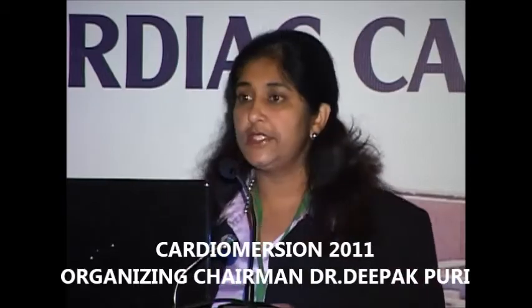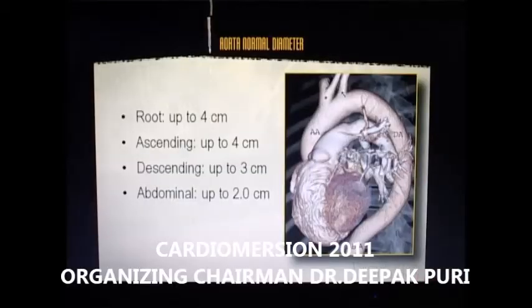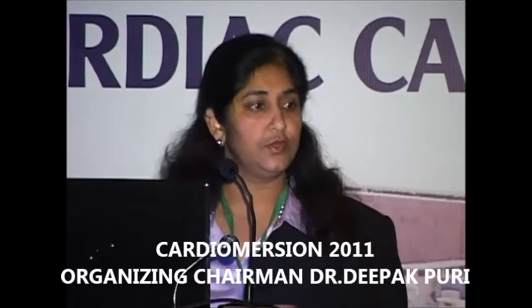Just a quick reminder to everybody about what the normals for the aorta are. This varies from institution to institution, but what we follow is that the root and the ascending aorta should be 4 cm, the descending aorta and the arch should be 3 cm, and the abdominal aorta 2 cm.